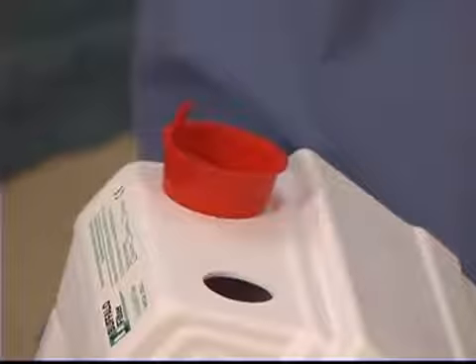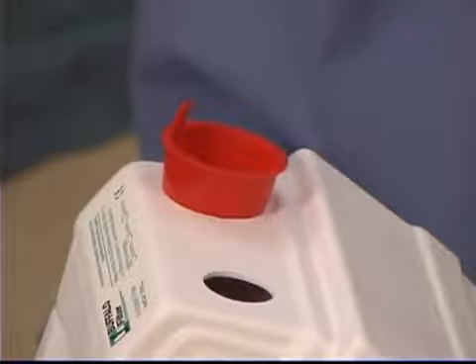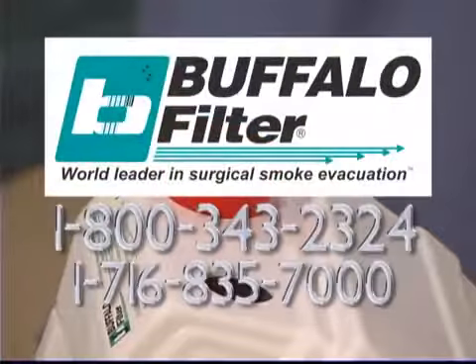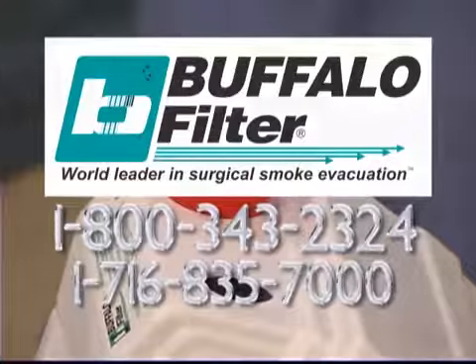It is important to note that the red caps removed when inserting a smoke evacuation tube should be retained to replace when a tube is not in place. Additionally, ports that are not in use should remain capped to prevent decreased suction and prevent fingers from accidentally going inside the filter. Consult your Buffalo Filter representative for recommendations on the best filter to fit your unique surgical needs.